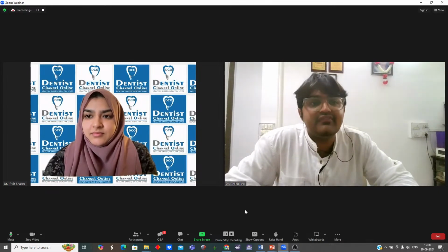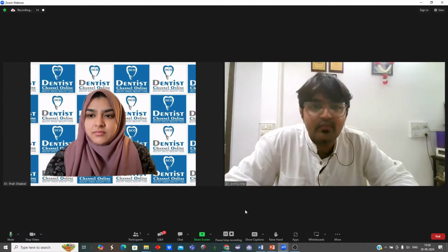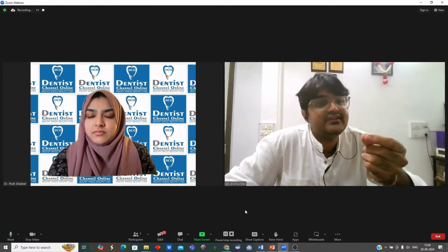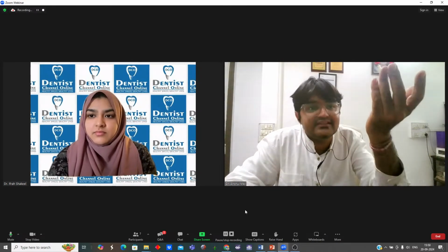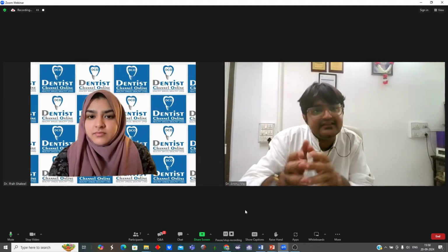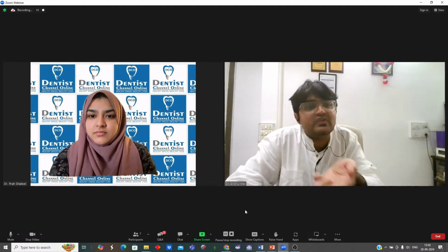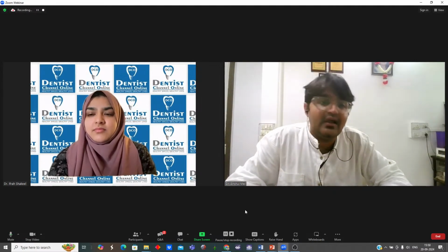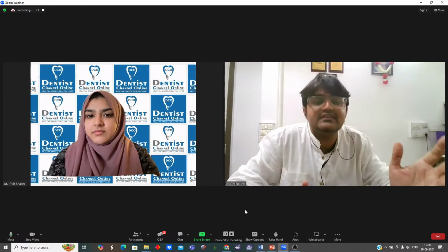But if you are looking at atrophic cases, like a sinus lift because there is no bone, or you are going for a zygomatic implant or pterygoid implant, yes, I will recommend a CT scan, because a CT scan will give you the thinnest part also. If there is a subperiosteal bone at the bottom, when you open the flap, you cannot directly see the sinus. But if you see the CBCT, you will get a window in that area, but practically it's not a window. There is some thin layer of subperiosteal bone also there, that you can get from a CT scan. So in the condition where you want to see the atrophic region, I will go for the CT scan.